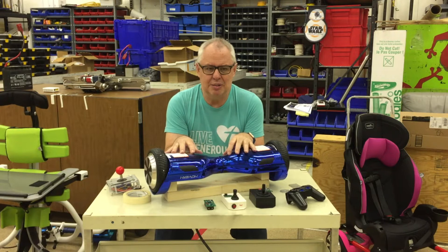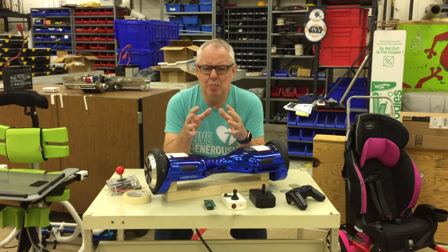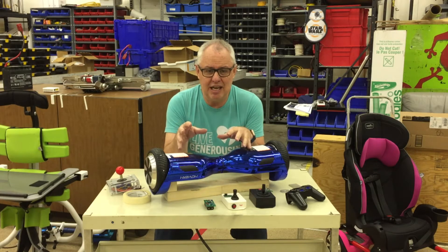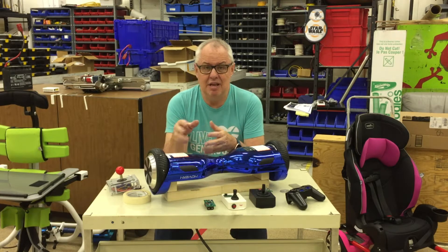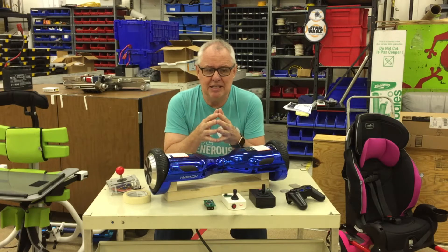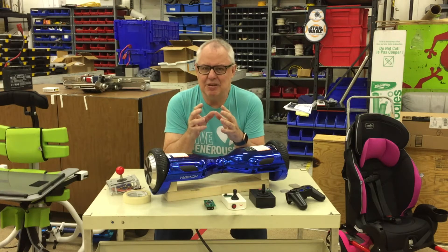So why hoverboards? These devices provide the ideal platform to adapt for a range of applications. They're self-contained, they're relatively attractive, they're rechargeable, they're powerful and yet they're very quiet. Plus there's an active community of hackers that are already adapting them to their specific needs, but I wanted to make that adaptation even easier.